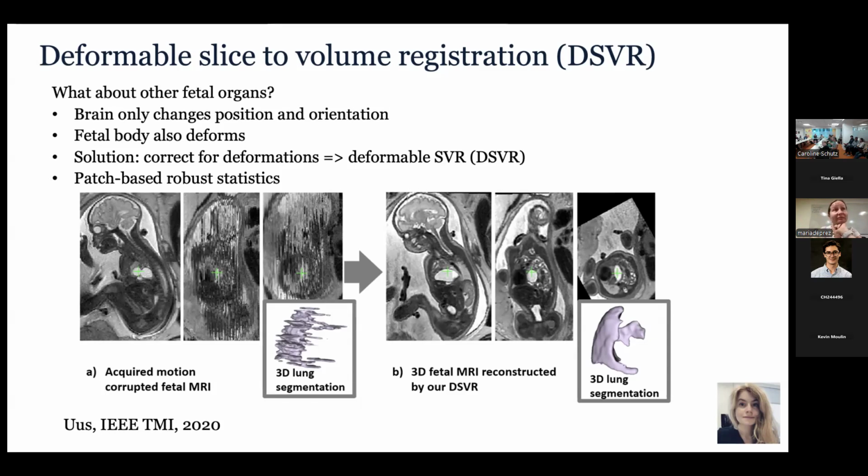And for reliable results, how many stacks do you usually put in of the fetal body? I think it really depends on the project, but 6 probably as a minimum.